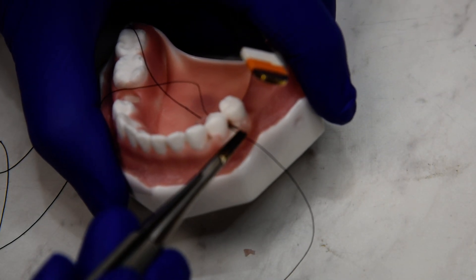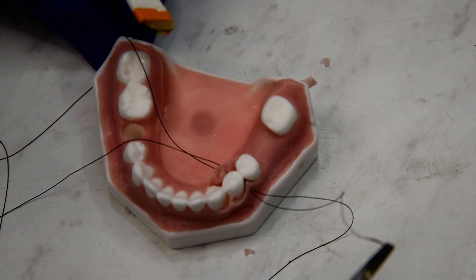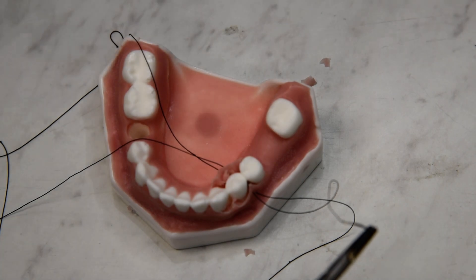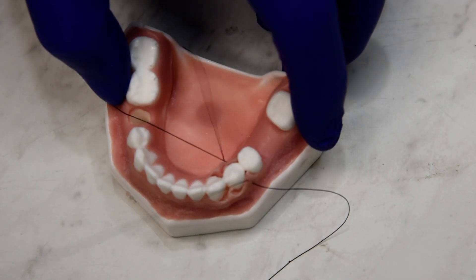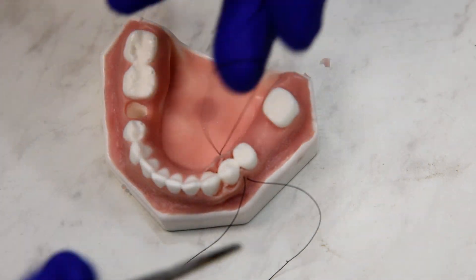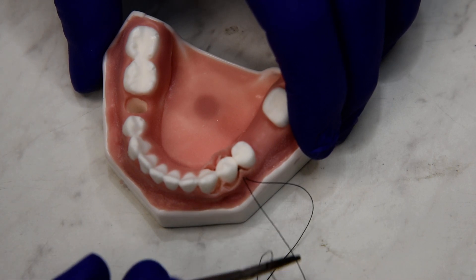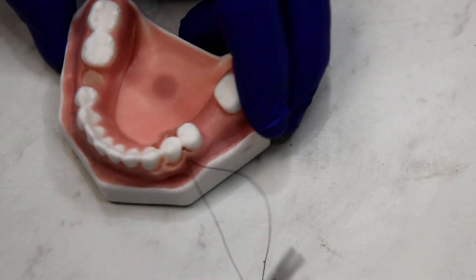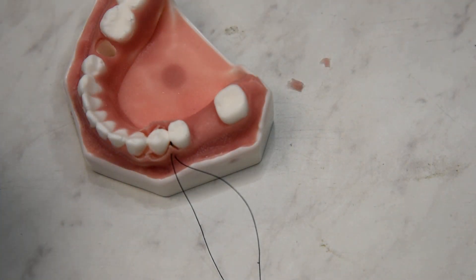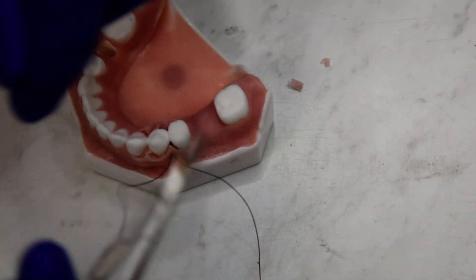So we have a mattress — a horizontal mattress that's just been turned 90 degrees. You'll see we have a loop on the lingual and we'll have a loop on the facial as well. And we'll go ahead and tie that.